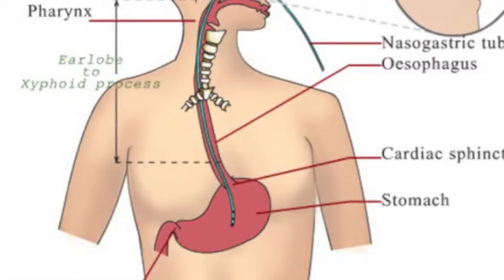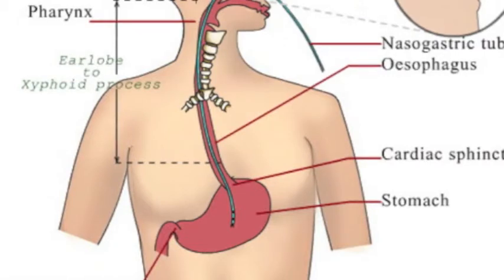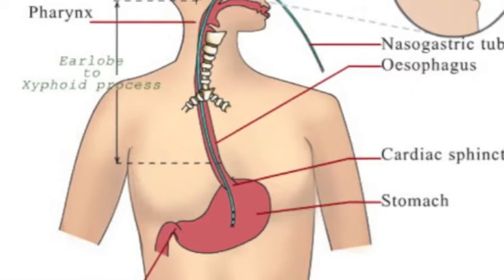So turn around. Good job. Follow directions, that's awesome. So we're going to measure from his nose to his ear, and then to his xiphoid process.